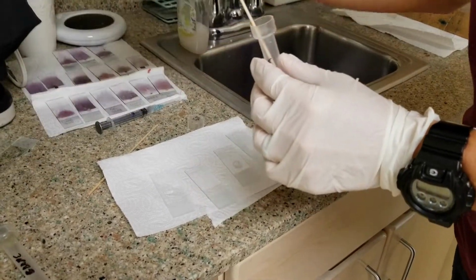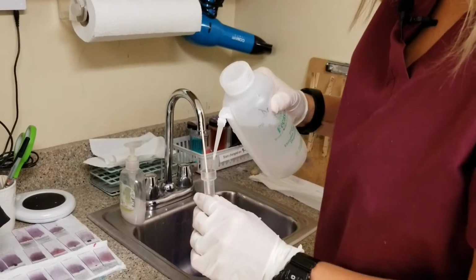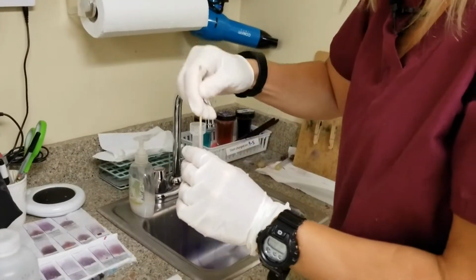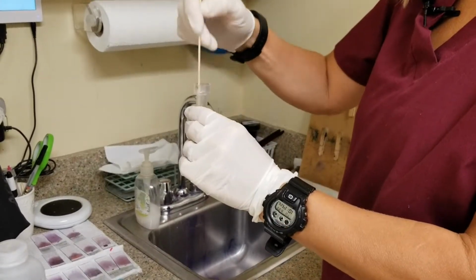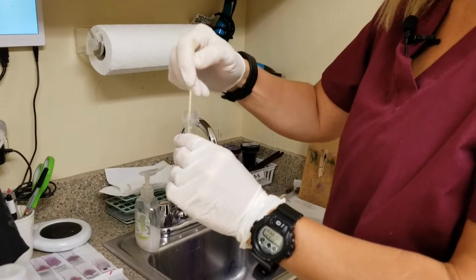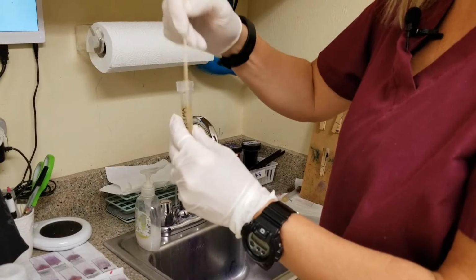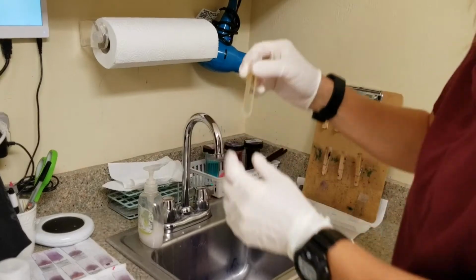For our float, we use Fecasol, and we go ahead and add this to our syringe case. Stir it around, and I like to jokingly tell the students here to make poop soup, because basically that's what we're doing, is stirring it around. We want to make sure that we get the feces broken up so the eggs can float to the top for us.